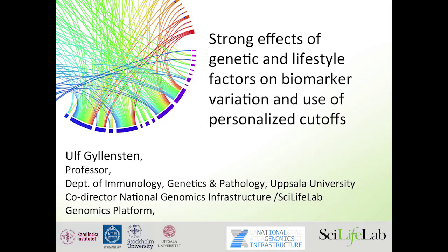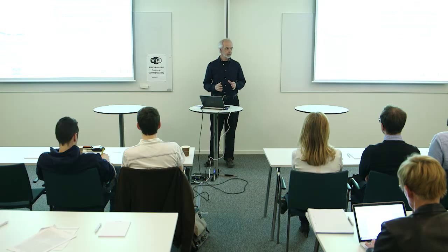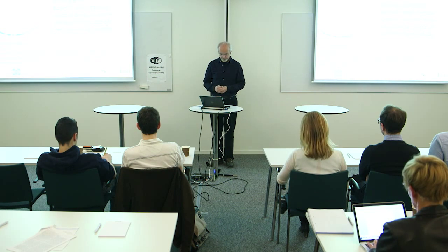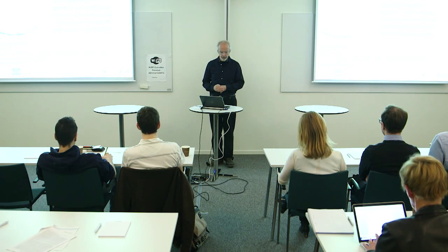So we started a project a long time ago looking at the genomics and genetics of a particular population in the northern part of Sweden that I'll tell you about. We went from genomics into transcriptomics, and then eventually we wanted to look at some of the protein profile of that population. Our first effort was not really working with Olink and this technology, but actually working with MS. That was a sobering experience, in the sense that MS is a very powerful technology, but it's also a technology that takes a lot of time and a lot of processing time afterwards.